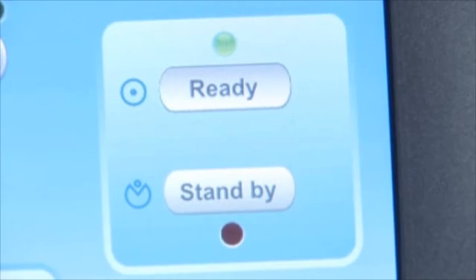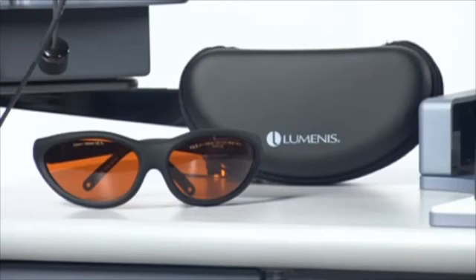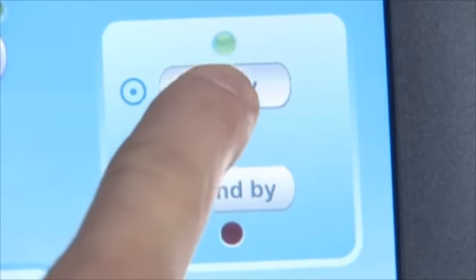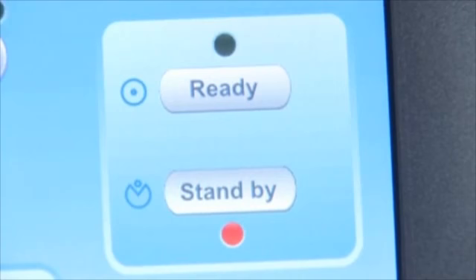Except during actual treatment, the laser must always be in standby mode. Maintaining the laser in standby mode prevents accidental laser exposure if the foot switch is inadvertently depressed. Verify that all persons in the treatment room are wearing the appropriate laser safety eyewear before placing the laser in ready mode. In ready mode, the foot switch is enabled and the treatment beam is available. In standby mode, the foot switch is disabled and the safety shutter is closed. No treatment beam is available.